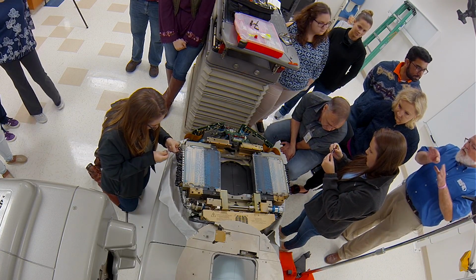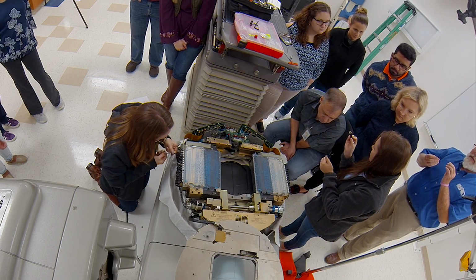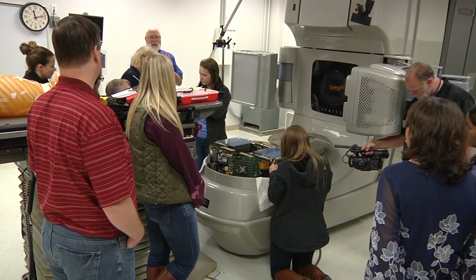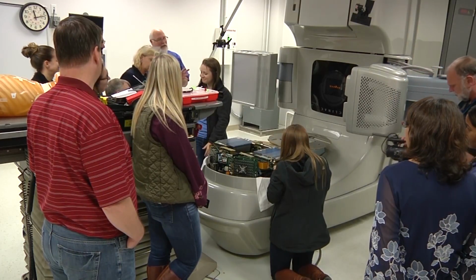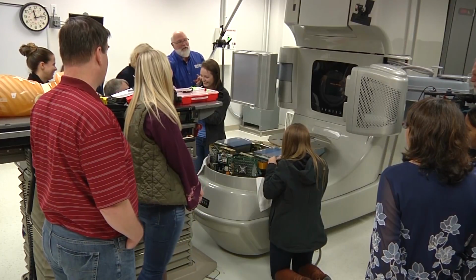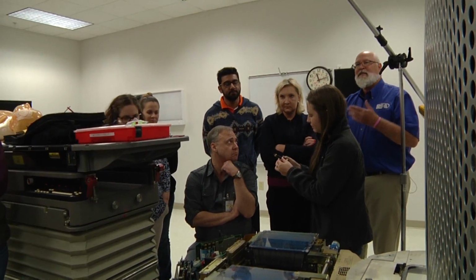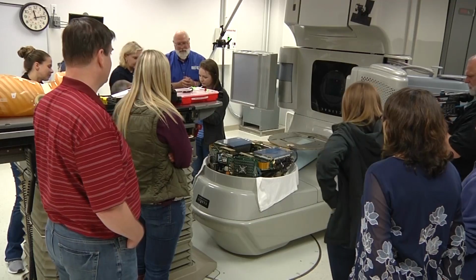Another thing to look at for the motor, if it looks wet, a lot of times, hopefully you didn't have a patient that had an accident on the table, because then you might have a lot of them that are wet. We don't. But there's a transmission fluid inside the motor, so it's a little oily. If that leaks out, that's another indication that your motor's going to fail.